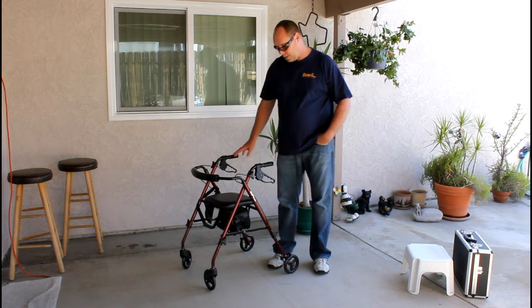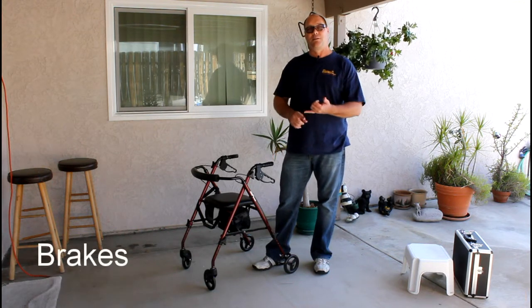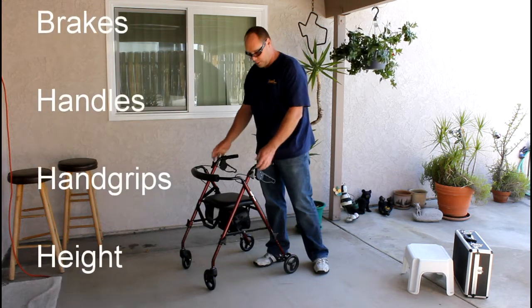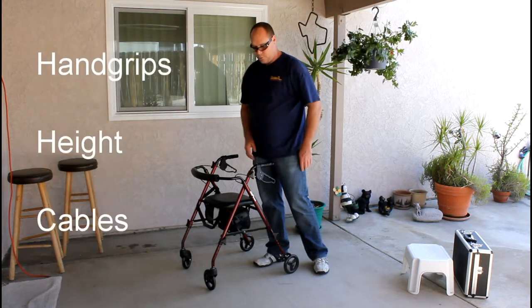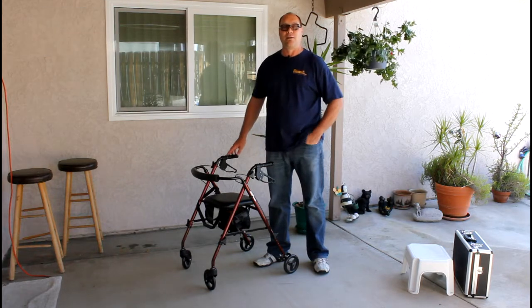What we're going to go through today is what goes wrong with a walker. We have the brakes, the handles, the hand grips, and we also have the height. And we're going to show you how to adjust cables as well, to keep them from grabbing onto things.